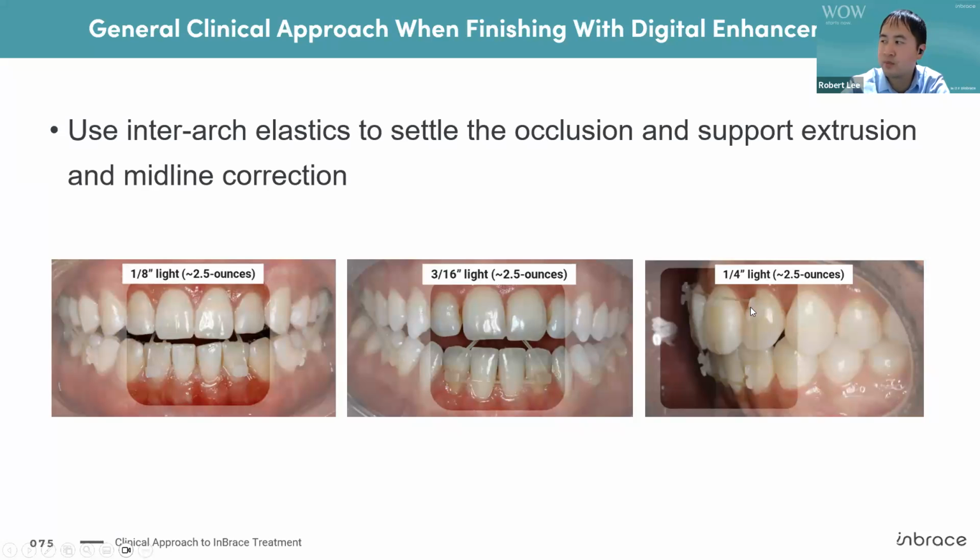They're highly motivated to prevent having buttons put on their front teeth. Because I tell them, if you can't do it, worst case scenario, I just put some clear buttons on the upper front teeth. And that works really well as well.